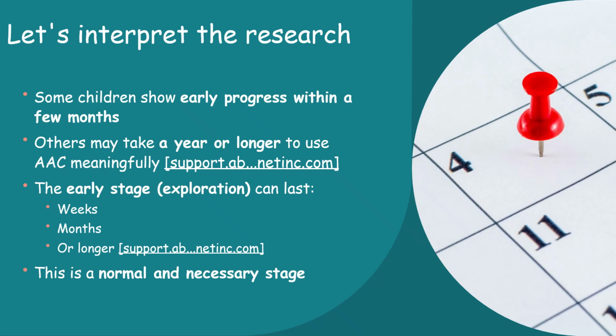The early stage, which is the exploration stage, can last from weeks to months or longer. That's the stage where the child might be looking at it but not initiating any communication with it, where the child may not even be looking at it but they're still listening and watching in their own style, or where they're tapping away at buttons. That is the exploration stage, and it can last a long time, and that is okay, and that is a really good stage to be in, and it's really normal and necessary. A lot of the feedback I get is, oh, they're not really looking at it, oh, they're just tapping. Absolutely perfect. That's amazing, and we should really be encouraging that as adults who are the communication partners.